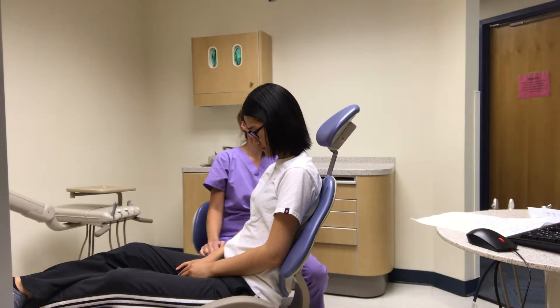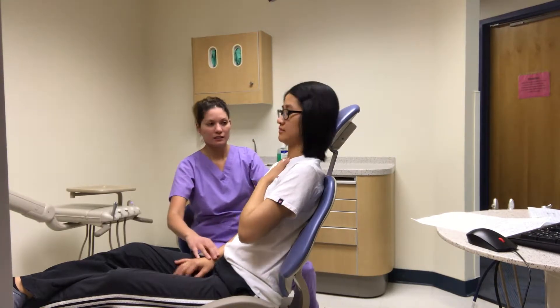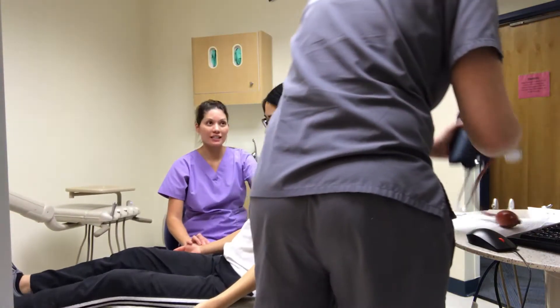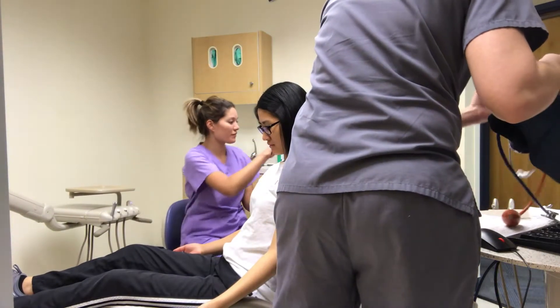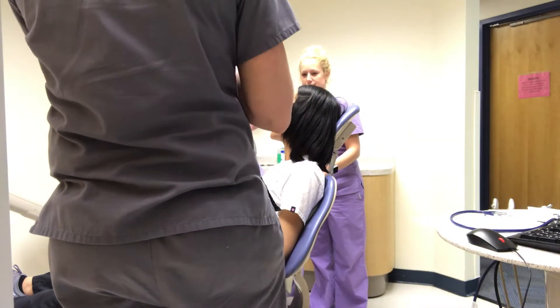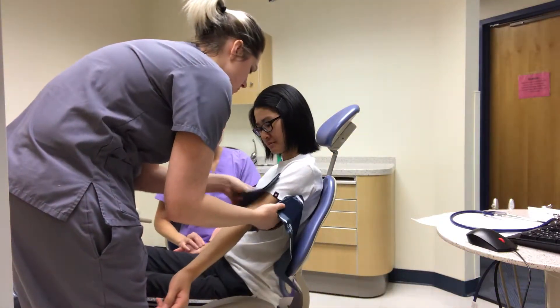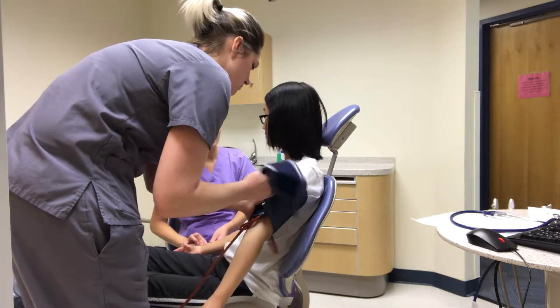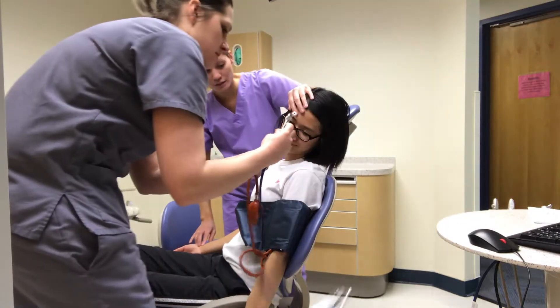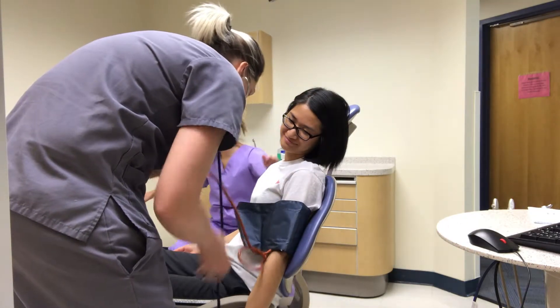And Angela, are you there? Can you help me take vitals for Amanda? I'm going to get some nitroglycerin whenever Kelly gets back. Okay, put this under your tongue. Here you go. Amanda? Okay, no pulse. I'm sitting her back. Kelly, can you get the AED?